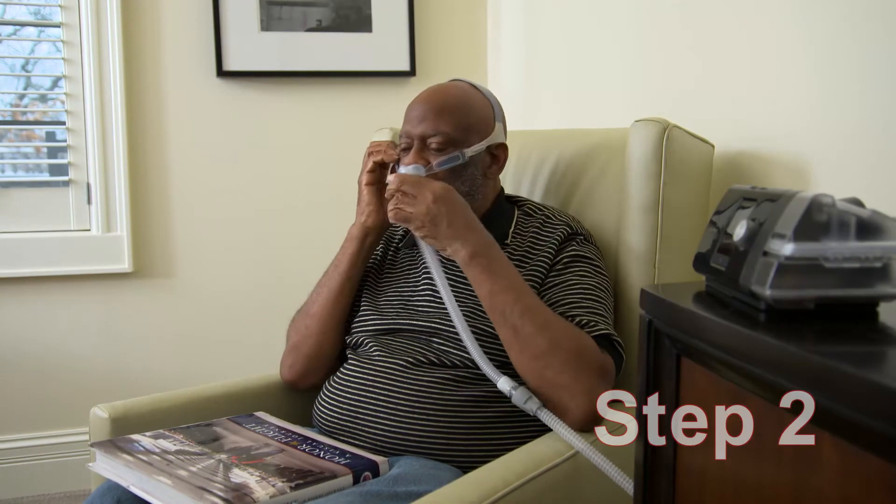Step 2. Wear your mask attached to the device with the airflow on. We recommend you practice during the day while doing something relaxing and enjoyable, such as reading, watching TV, or doing a relaxation exercise. Try not to focus on your breathing — the PAP and you will learn to work together, and it's easier if you're focused on something else. Do this for 20 to 30 minutes per day. We recommend daily practice for at least a week, or until you feel very comfortable with this step.